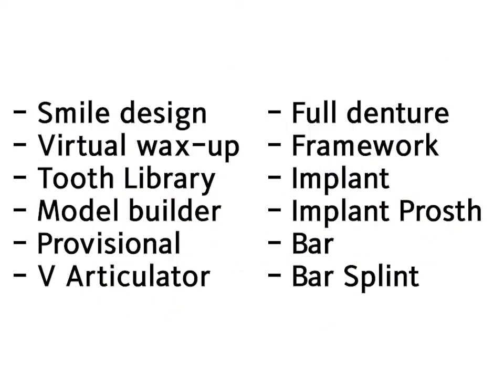The next is provisionals. Various software modules can be used to design temporary restorations based on the preoperative scans. This type of software can be used to design the temporary restorations by replicating the original anatomy of the tooth, if acceptable, or by relying on in-house tooth digital libraries.